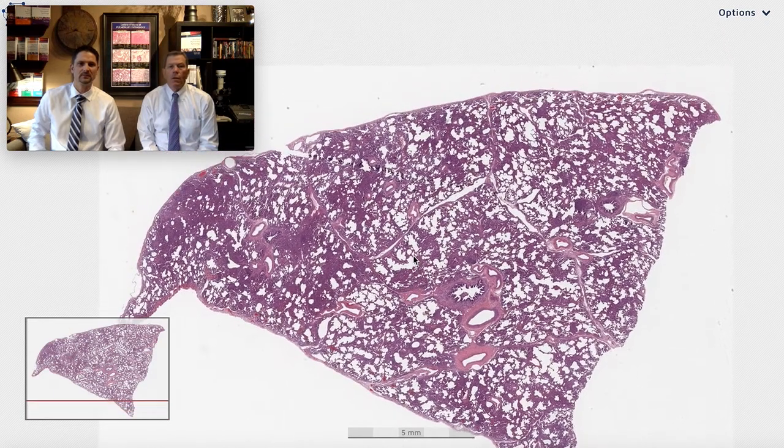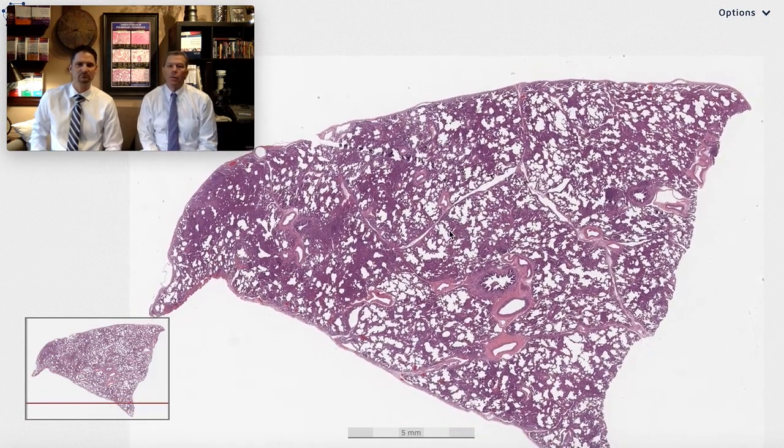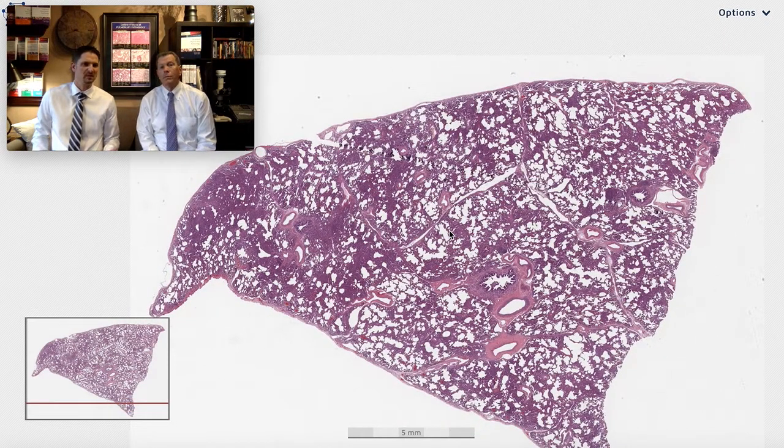So here we have our biopsy from scanning magnification. Basic questions here at Six Patterns — simple questions. Blue or pink? To me this looks blue and it's still got a lot of holes in it, so it's not solid blue like it might be a tumor where you'd expect more solid. This is kind of moth-eaten blue.